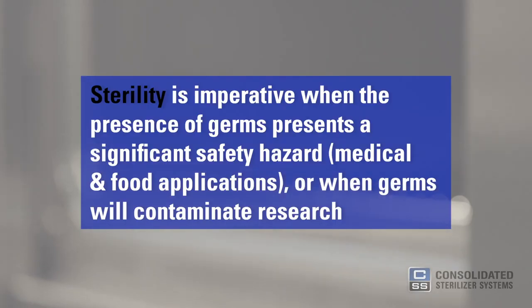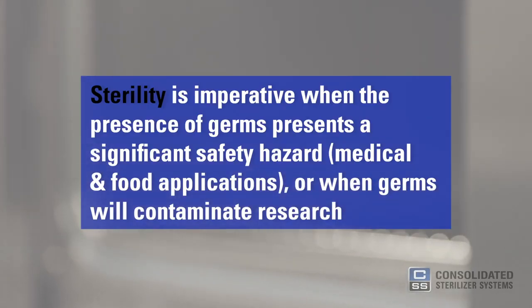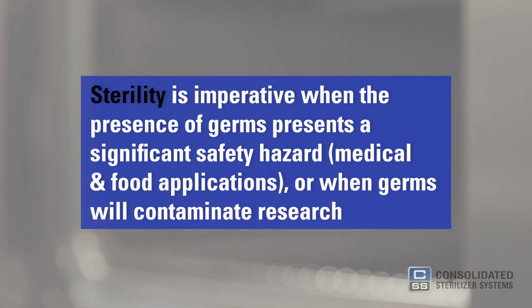Let's start with some basic terminology. Sterility is imperative in situations where the presence of germs would present a significant safety hazard. Think hospitals, research laboratories, food production facilities, and so on.